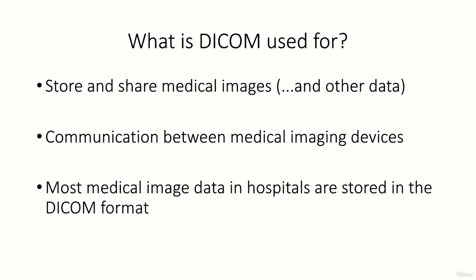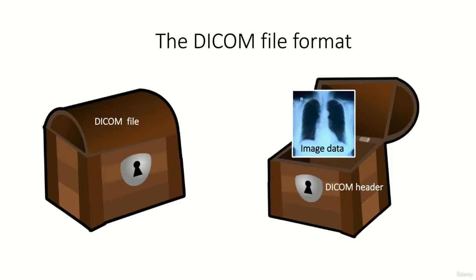This standardized file format allows the communication between medical imaging devices. Thus, most medical imaging data in hospitals are stored in this file format. And you can be quite sure that if you get some medical imaging procedure taken, your images are actually stored as DICOM files.